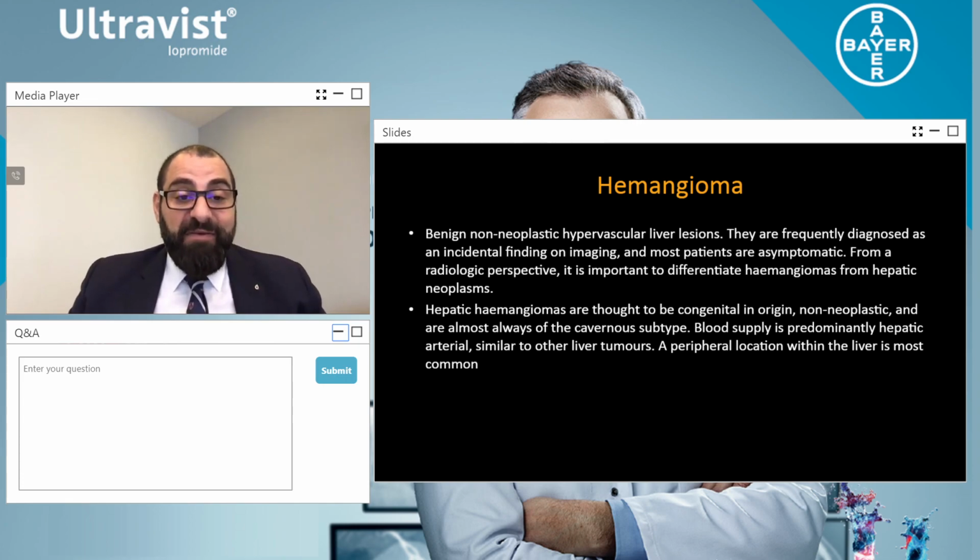So if you ever have a patient who has a primary mass in the breast, in the brain, in the lung, or anywhere else, or in the gastrointestinal system, always prove that that lesion is not a metastasis before you assume it could be a hemangioma, because that then changes the patient's treatment outcome significantly. So the importance here is, with hemangioma, always give a good delay time.